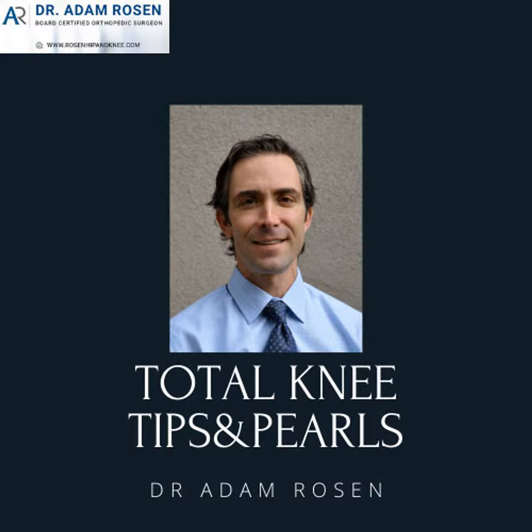So I will take fluid, and then I'll typically take something from the femur and the notch. I'll take something from the tibia, the notch. I'll typically send the synovium. If I ream the femoral tibial canal, send those reamings. Again, usually looking for the area that looks the most suspicious, but always an odd number. At least 3, preferably 5. Occasionally, if I have a strange suspicion, I may send 7 if it looks really questionable.